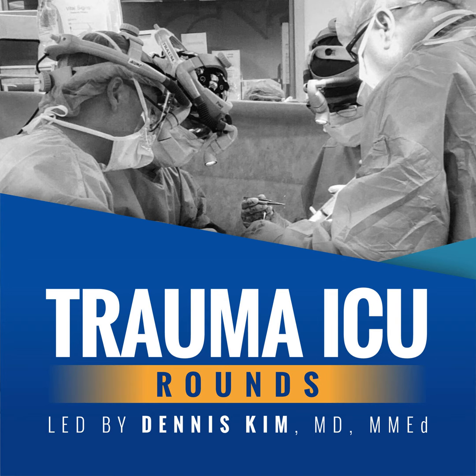Finally, in a pressure supported control mode, the peak inspiratory pressure represents the sum of the set PEEP and set pressure. The mean airway pressure is a super important concept, and it's really the average pressure over the entire respiratory cycle and includes PEEP, or the positive end expiratory pressure. PEEP is obviously a critical variable, and increasing PEEP will increase the overall mean airway pressure by preventing alveolar collapse or atelectasis and through the recruitment of FRC.